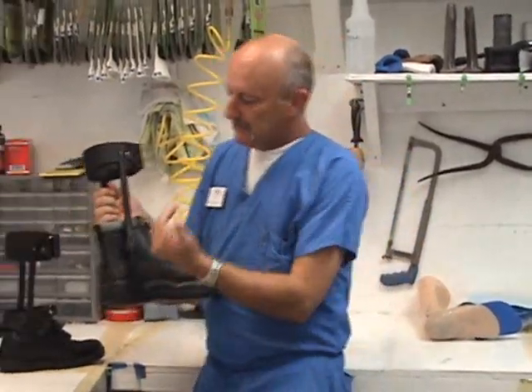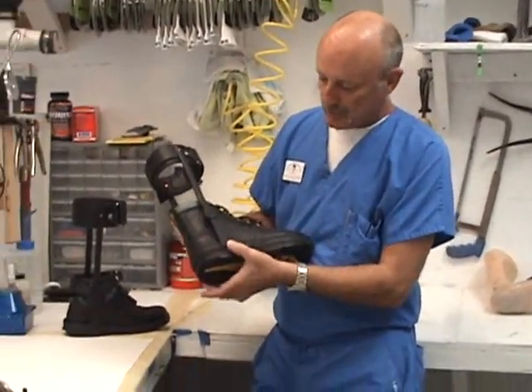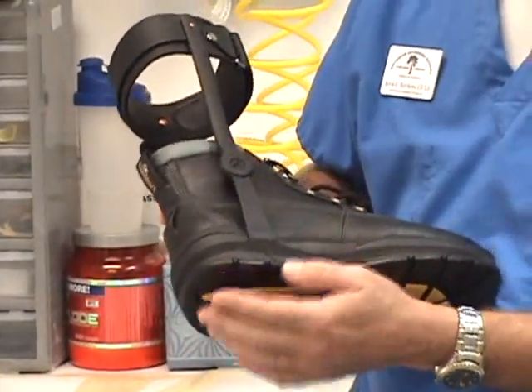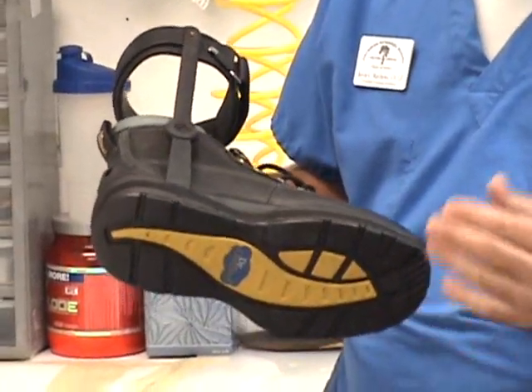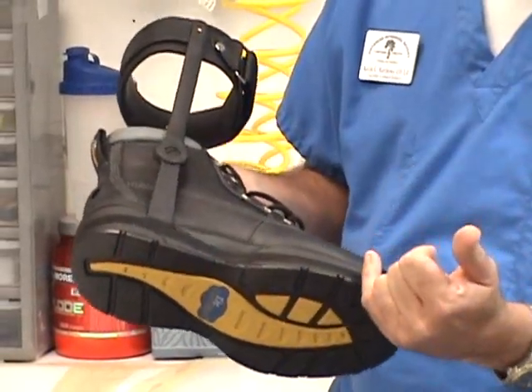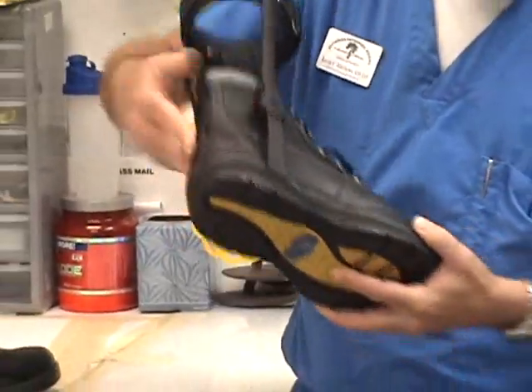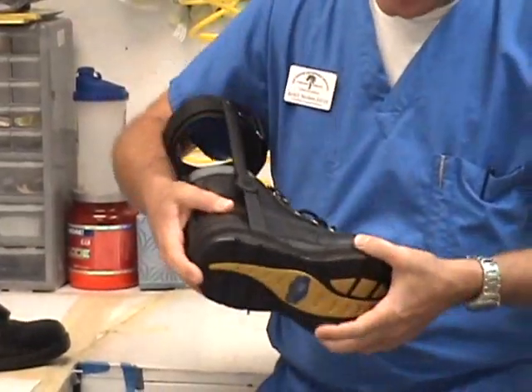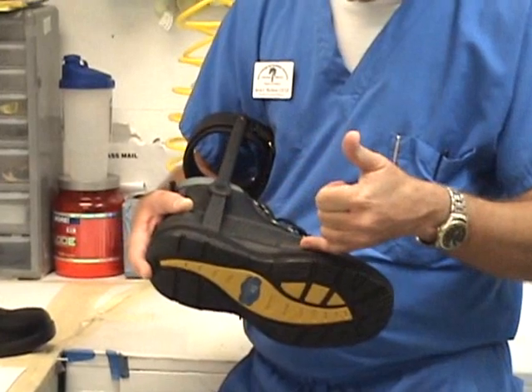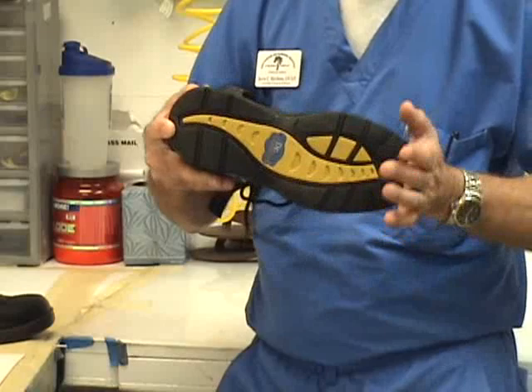When you make a limited motion AFO, there's a stirrup that's mounted to the shoe. The sole is pulled off, the stirrup is mounted, and then the sole is put back on. This design has a rocker bottom. When you want to limit motion, you either need to use a stirrup with a long tongue to rigidify the shoe — because you can't have the shoe bending — or you need to add a steel shank to rigidify the sole.